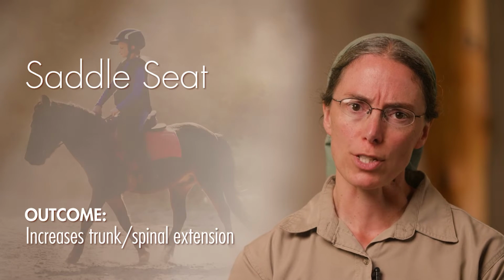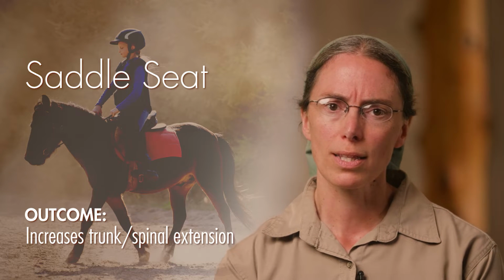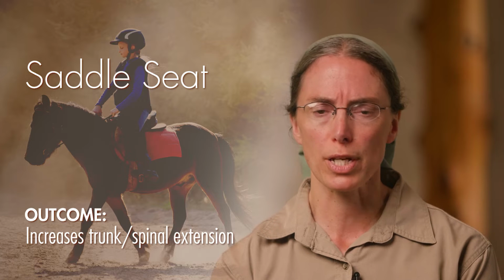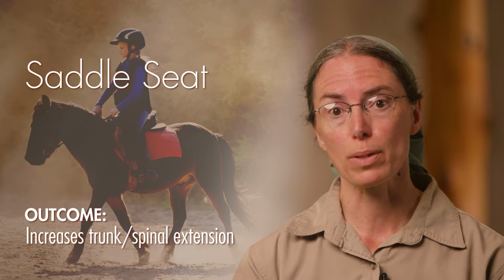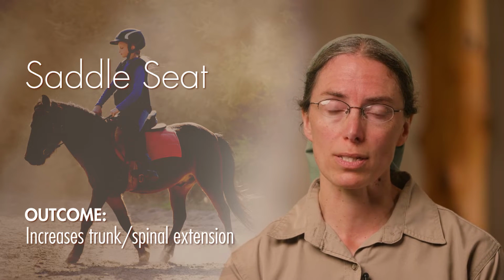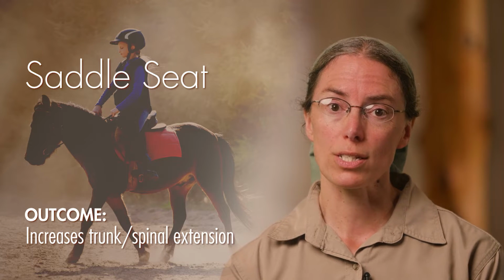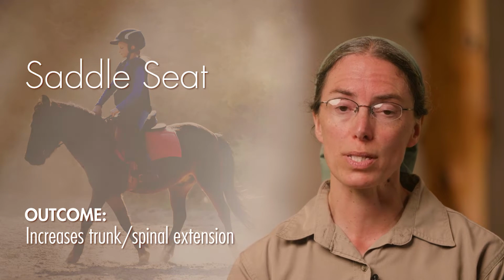Some of the beginning research in adaptive seating was with the so-called saddle seat. This placed the child's legs with abduction, outward rotation of the hips, and an anterior tilt of the pelvis with midline trunk posture and equal weight bearing through the lower extremities. For children with cerebral palsy, when placed on saddle seating, findings showed that trunk and spinal extension was increased.